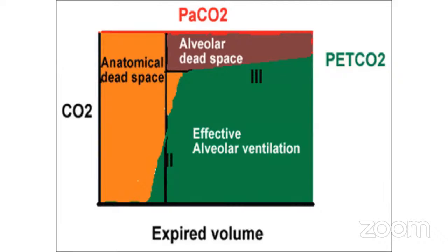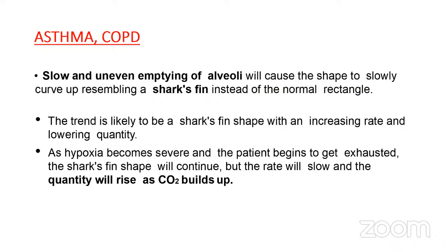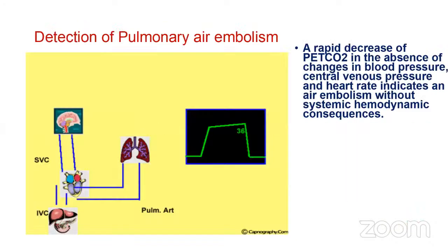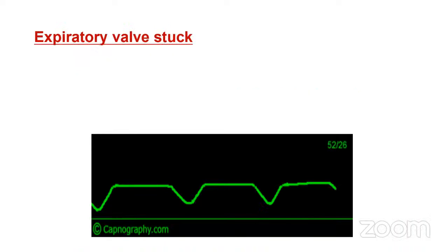Oh, it is there in the same slide. No, I'll just show it. That 5 to 7, I have shown, no, one. Normal. Yeah, 5 to 7. Otherwise also, in anesthesia we used to do like that only, no? Yeah, 5 to 7. You said there it is PaCO2 minus ETCO2.